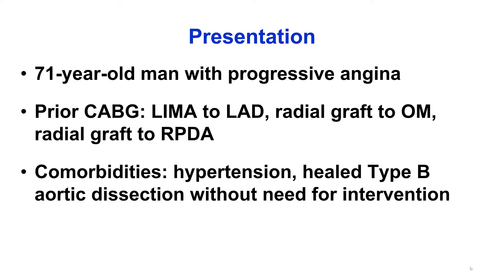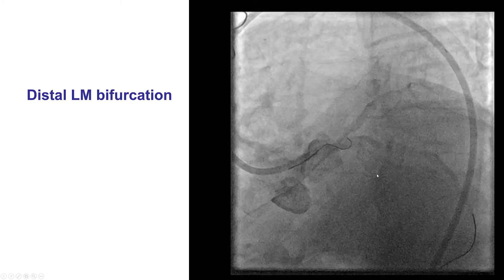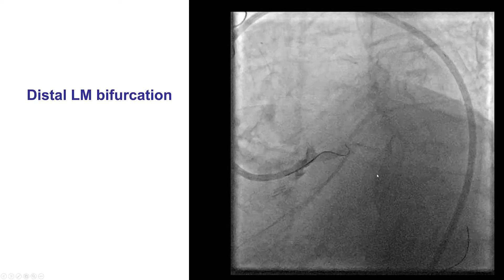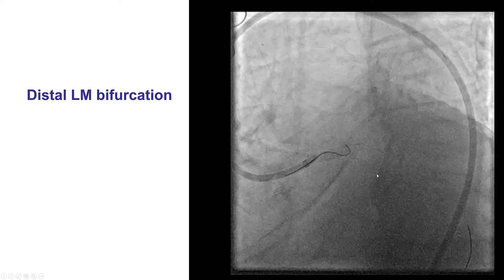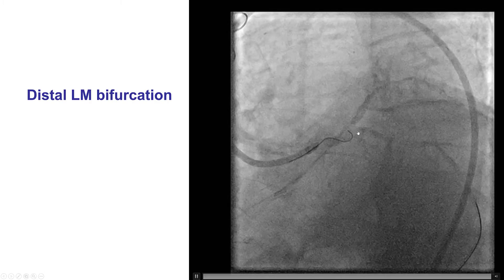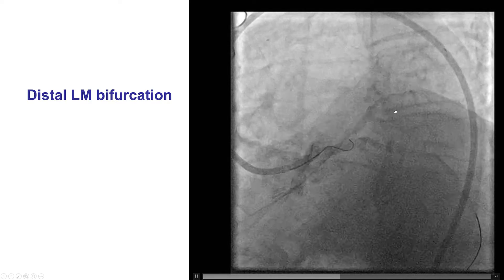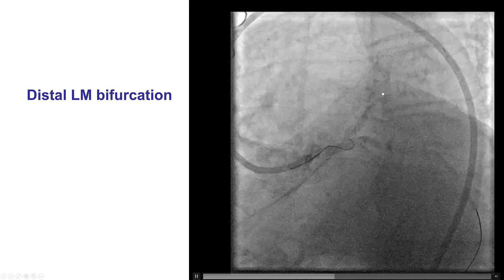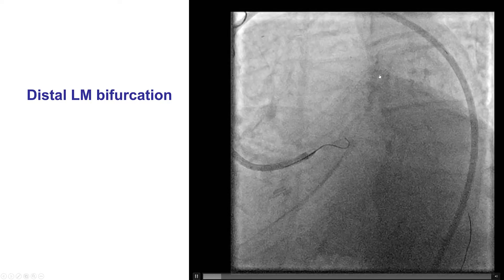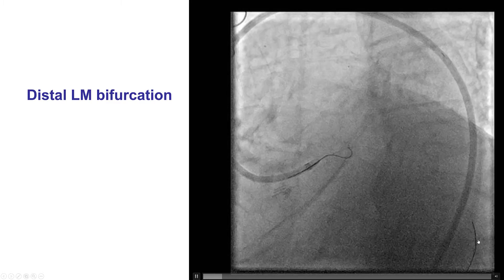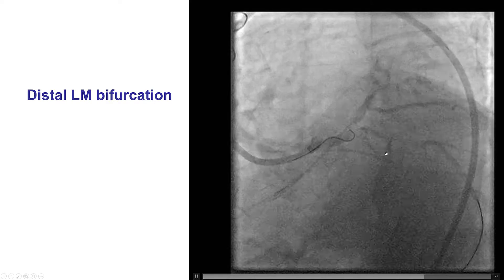The patient was an elderly man with progressive angina. He had previous coronary bypass with LIMA to LAD, radial to obtuse marginal, and radial to posterior descending artery. He also had a healed type B aortic dissection. He was referred for PCI of a distal left main ostio-circumflex bifurcation lesion, with a significant lesion at the origin of both vessels. The LAD was significant because two large diagonal branches were originating before the LAD occlusion, which was supplied by the LIMA, and there was also a significant amount of lateral wall territory supplied by the circumflex.